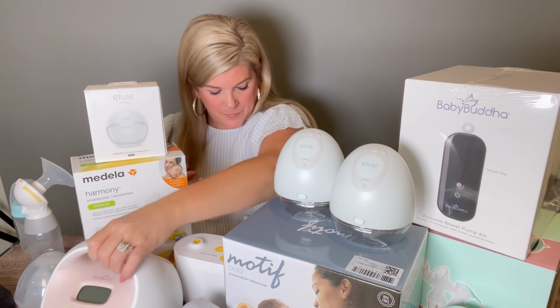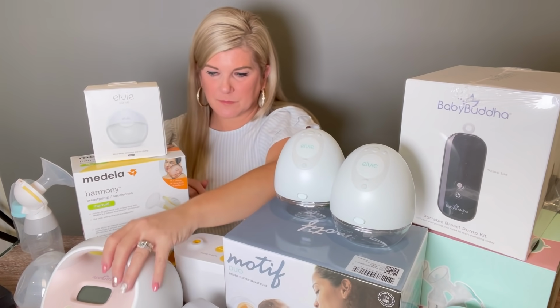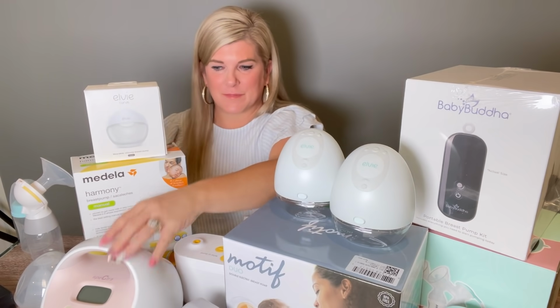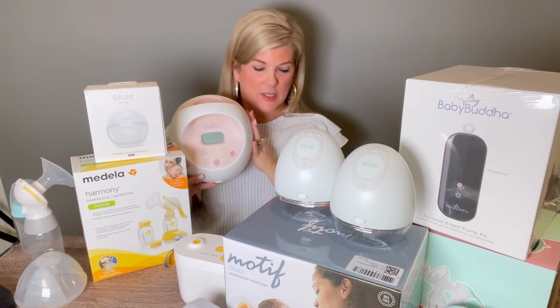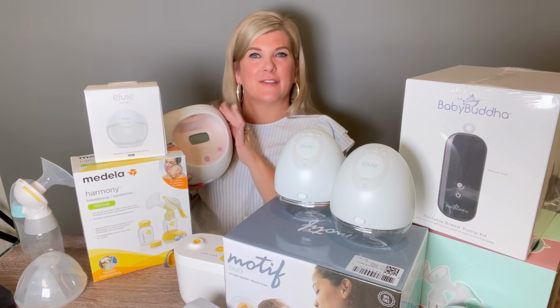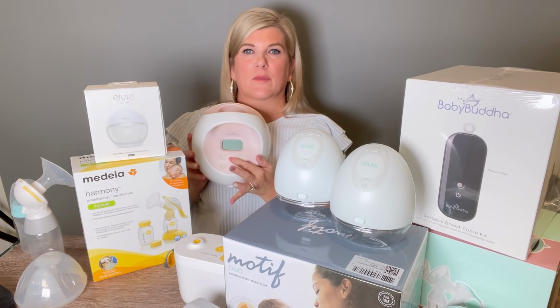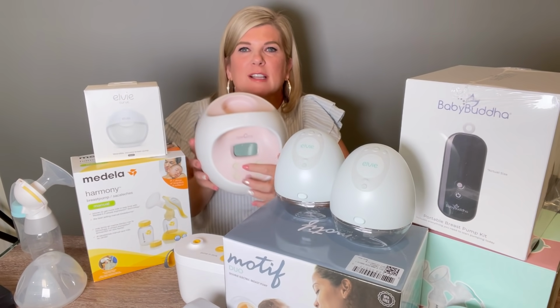So I'm going to go over the standard features on a breast pump as well. And again, there are so many different combinations of all these different pumps, but there are a few basic features that you're going to want to know. So obviously they have an on-off button, right? Some of them even have a little night light, but then you have your letdown mode, right? I don't know if you can see it on here. It looks like little waves.